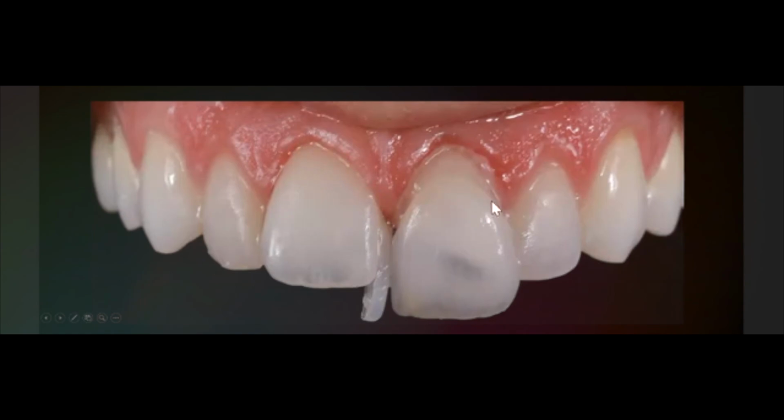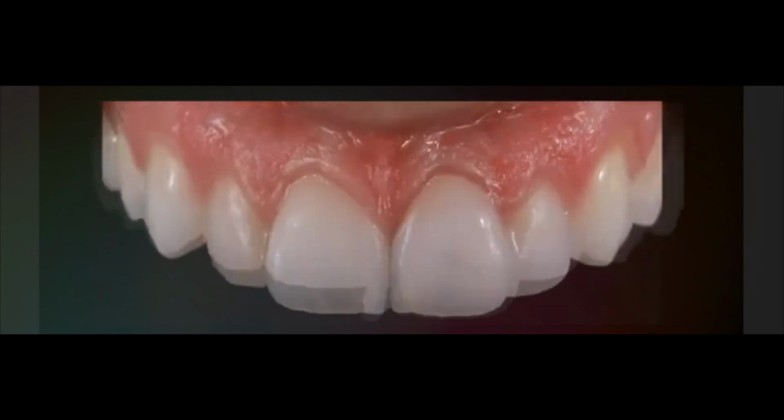Here it's not pink, because we didn't place it yet in the final position. But when we place it in the final position, you can see we get almost the same pink color. It is what I told you before about chameleonism. So we need to create the situation in this area, the most difficult area when we have to deal with a single central, in order to have chameleonism, to get the colors from the cervical prepared tooth and soft tissue, and to be more adaptive.